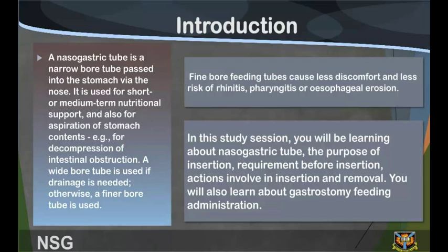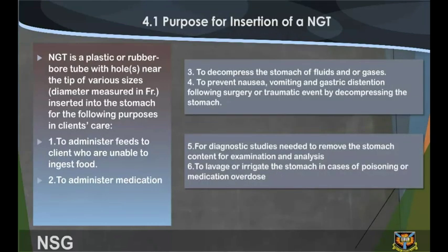In this study session, you will be learning about nasogastric tube, the purpose of insertion, requirements before insertion, and actions involving insertion and removal. You will also learn about gastrostomy feeding administration. Purpose of insertion of the NGT.